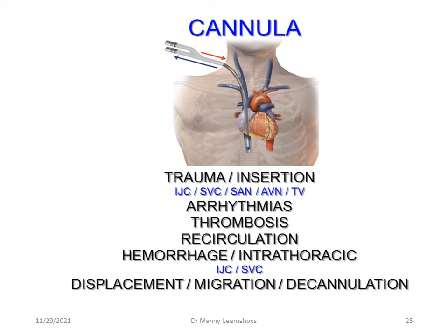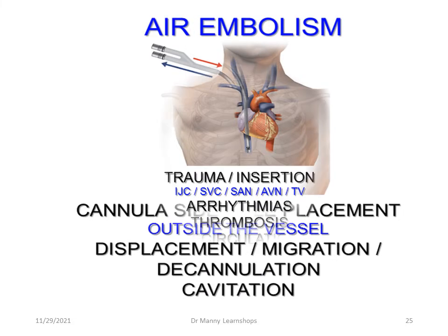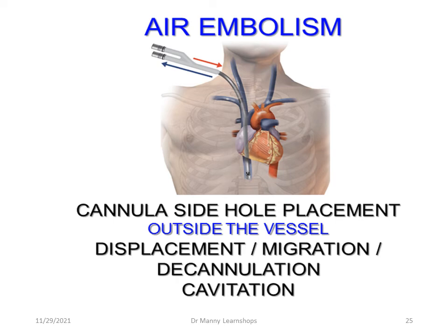or subclavian vein. There can be displacement, migration, or decannulation. You can also have air embolism, and this is when the cannula is outside the vessel through displacement or migration. Decannulation can occur, cavitation can also occur.